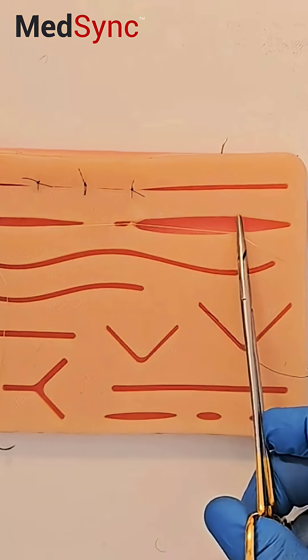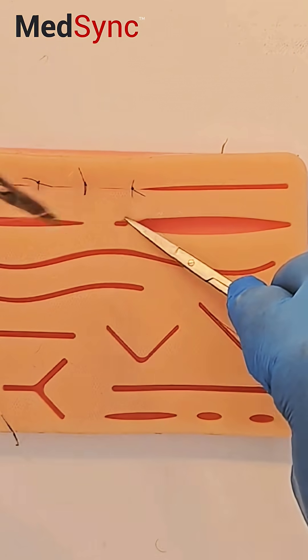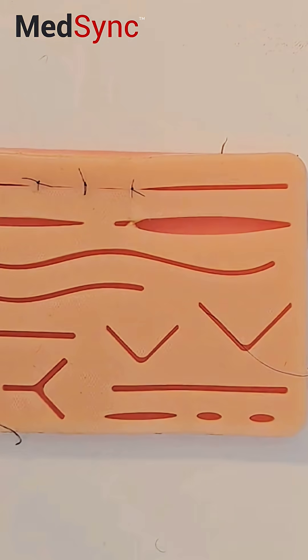So for the deep dermal, there's a buried knot, so you can cut this flush. I don't want to see the suture above the skin.